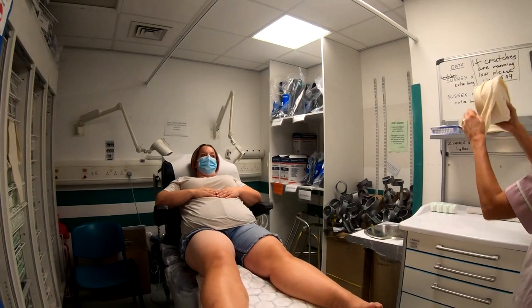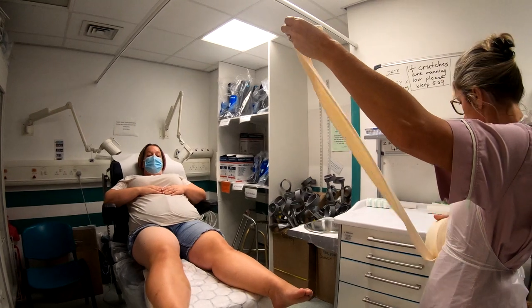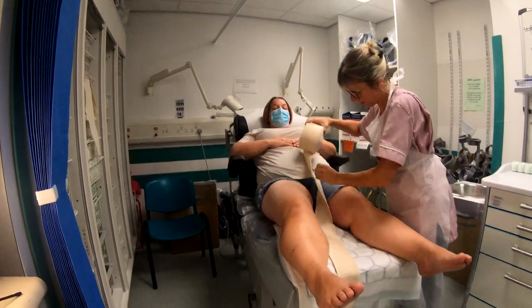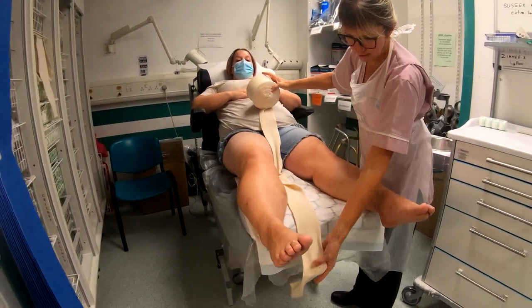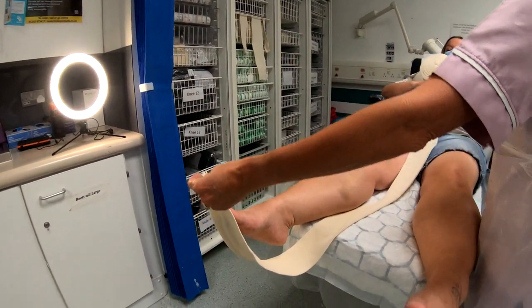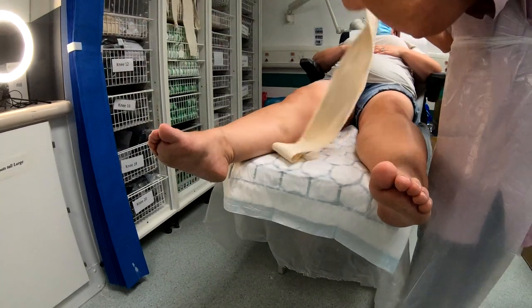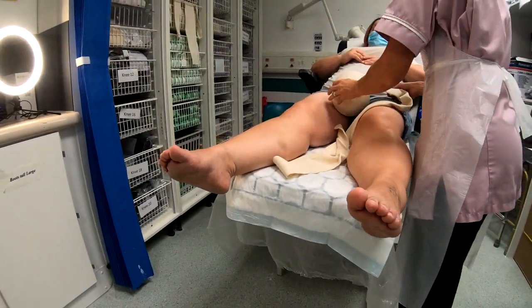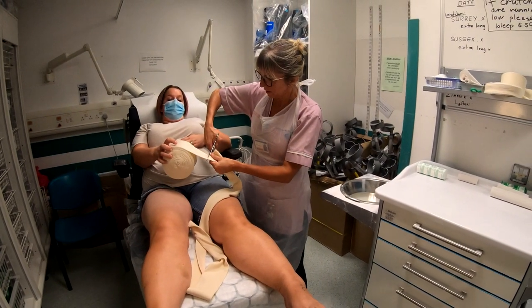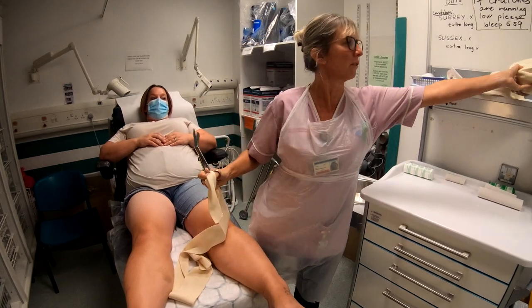We're going to use the large stocking net this time as we're going right up to the groin. We measure from underneath, making sure you've got plenty under the heel. I've done this much longer than you would think, because it's easier to cut some away if you have too much. I'd rather that, because it's very uncomfortable for the patient if you put one on and it's too short and you've then got to take it off.